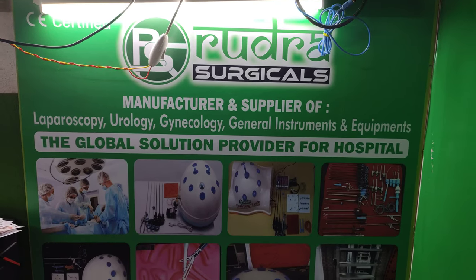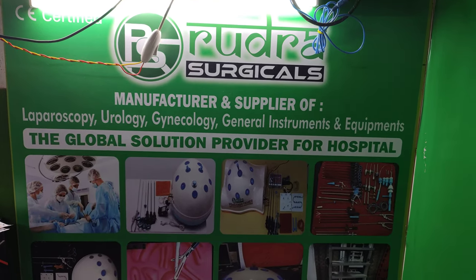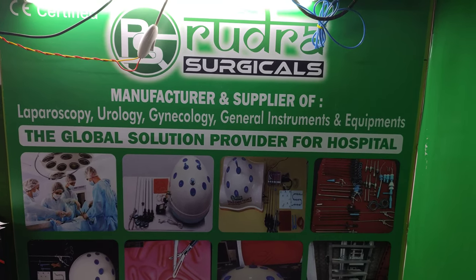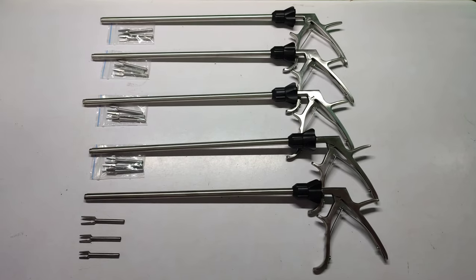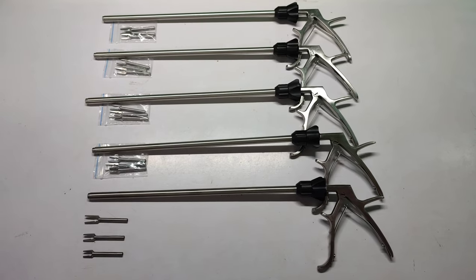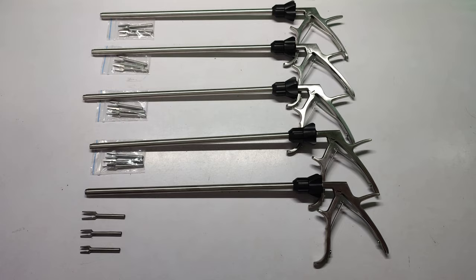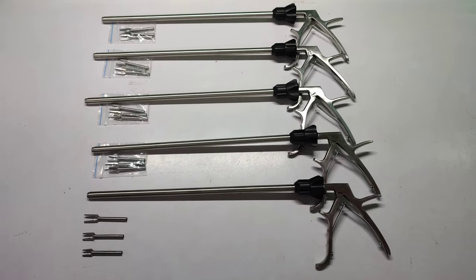Hi, this is Ajay Kumar from Rudra Surgical Mumbai. We are manufacturer and supplier of laparoscopy, urology, and gynecology instruments. This is a clip applicator, short jaw, 3-in-1, 10mm x 330mm, stainless steel, reusable and autoclavable.